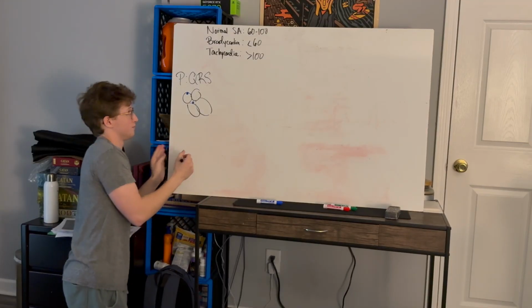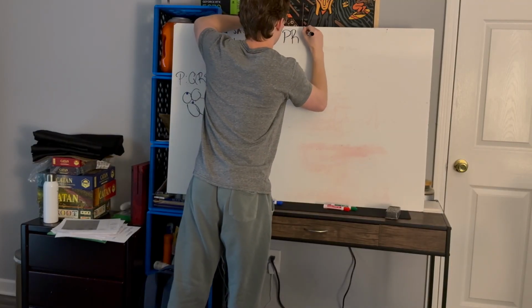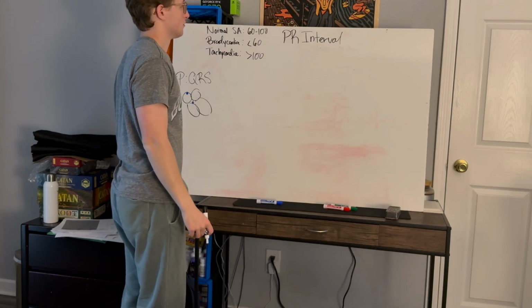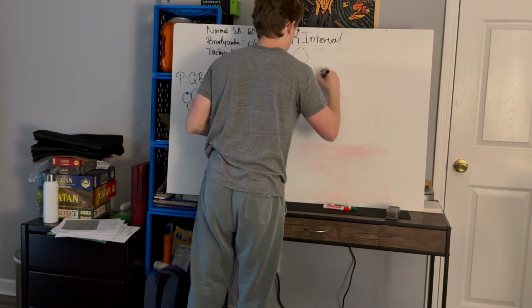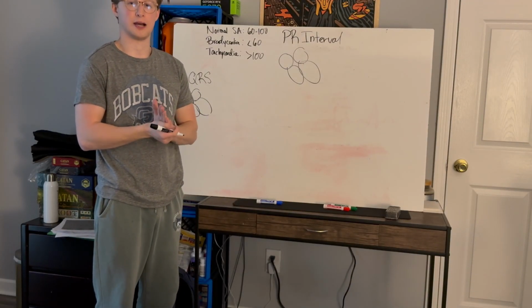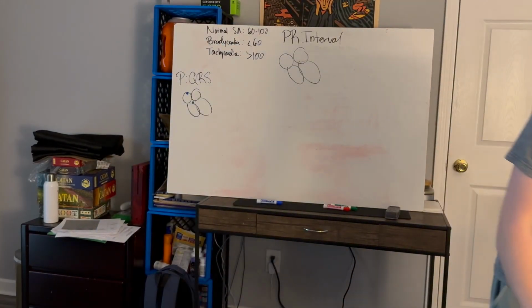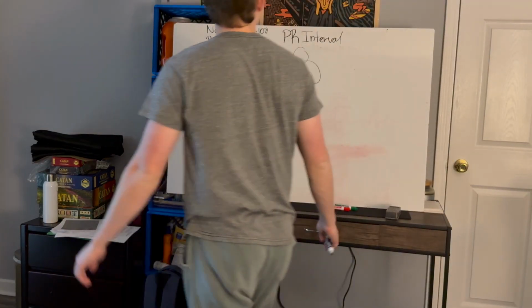Next, PR interval. Why does that look like I spelled it wrong? I don't know. What did we say PR interval was? Normal PR interval, 3 to 5 small boxes, 0.12 to 0.2 seconds. I swear I'm spelling that wrong. Why do things look weird when they actually aren't? No, it's correct. Okay, whatever.